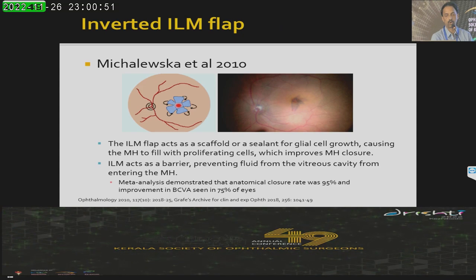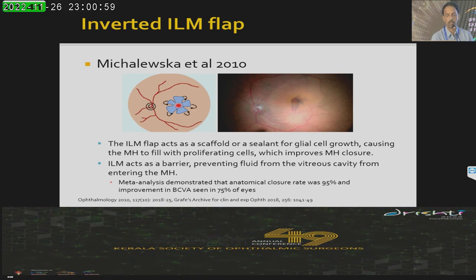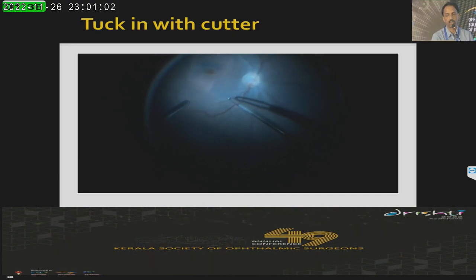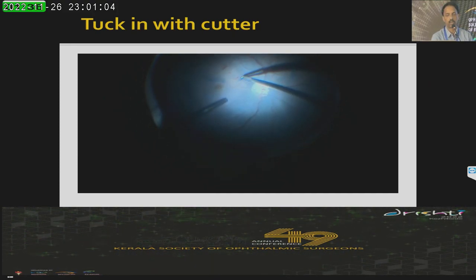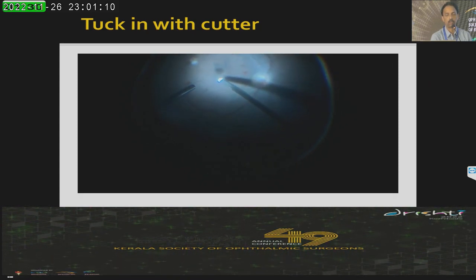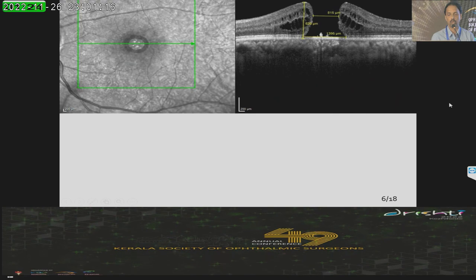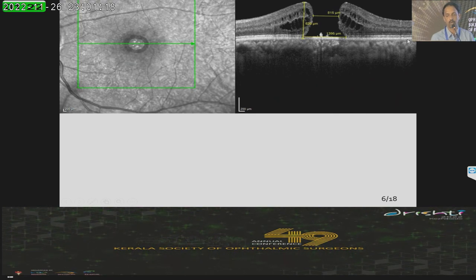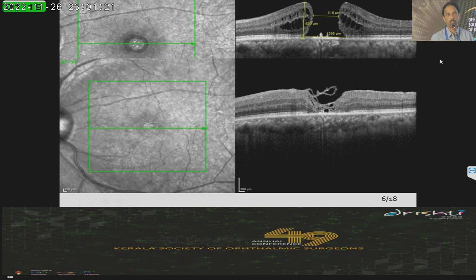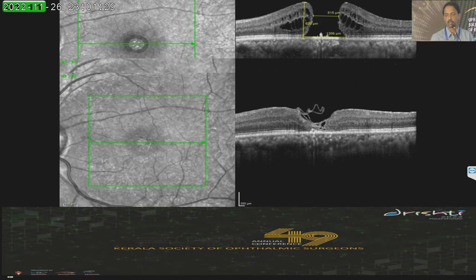Michalewska et al. introduced the concept of the inverted ILM flap, where you tuck in the flap into the hole. Meta-analyses have shown that anatomical closure rates are better and visual improvement is also better in these eyes. Different ways of tucking in exist. Here I am tucking in with the cutter itself, pruning the edges and then tucking with the cutter. You can see the ILM, and this is at one month and three months — ILM may be present for up to six months, and this is a type 1 closure.